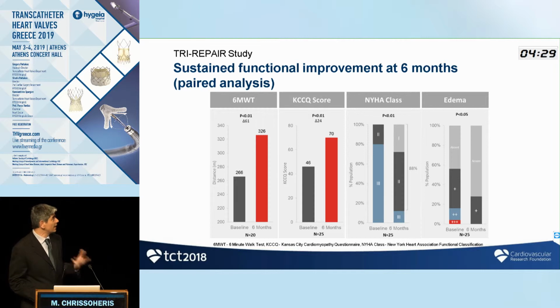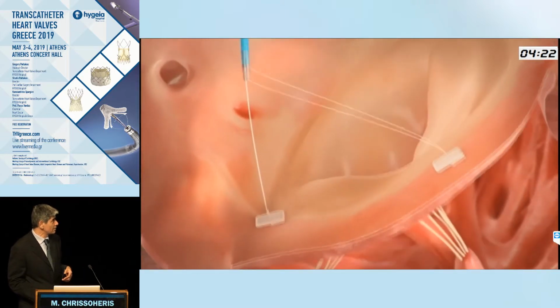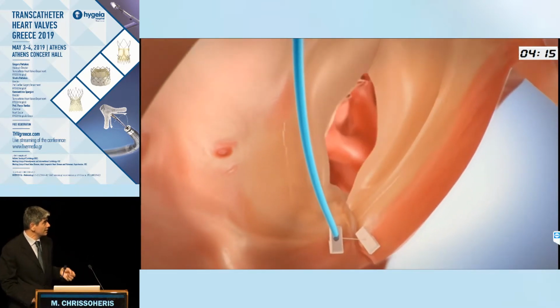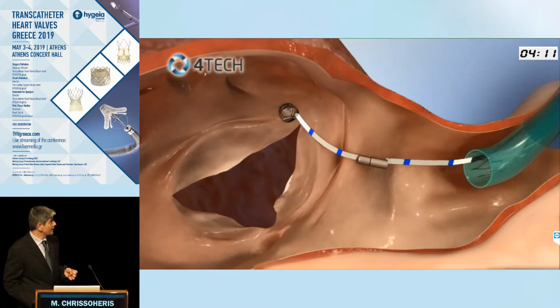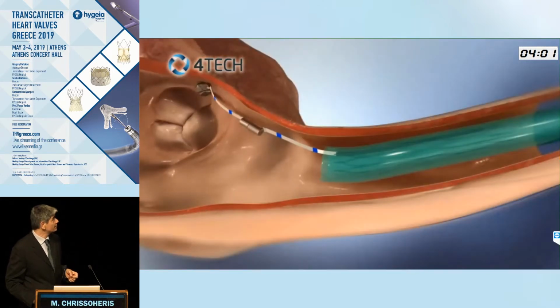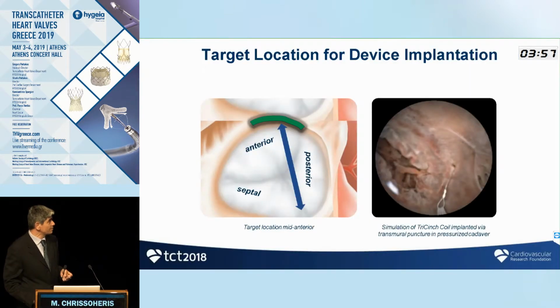However, this improvement, albeit modest, does tend to reflect in how the patients feel, and it's important as a technique and a technology. Another technique is the bicuspidization technique, the Kay technique that surgeons do, a TriAlign technique that decreases the posterior annulus, and the TriCinch technique also attaches an anchor to the lateral annulus, and by pulling it, decreases the septolateral dimensions of the tricuspid annulus.